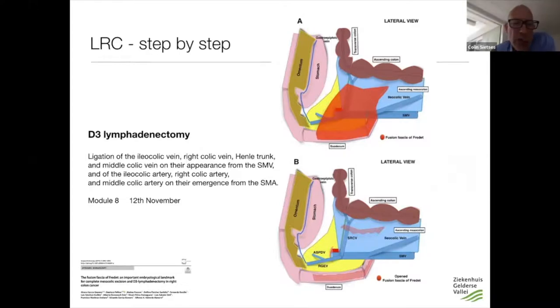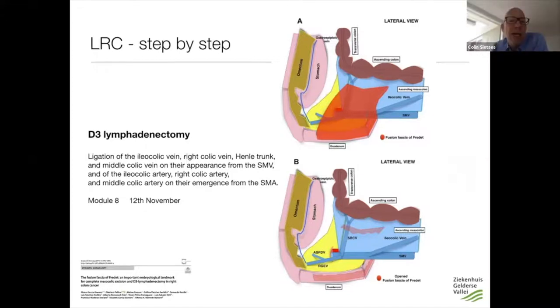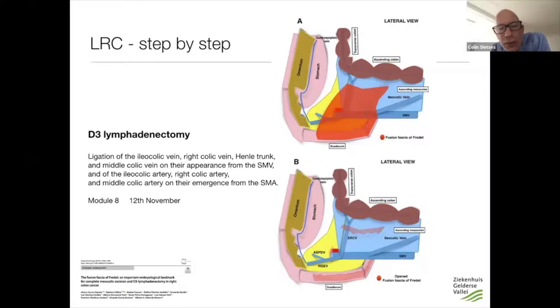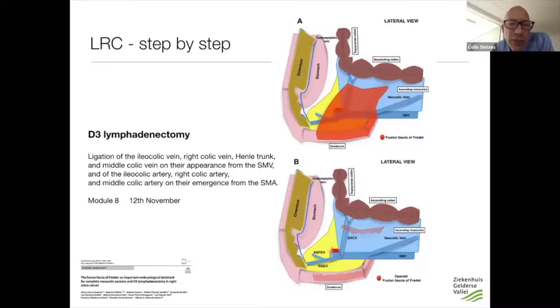D3 lymphadenectomy means ligation of the ileocolic vein, right colic vein, Henle's trunk, and middle colic vein all at their origin of the superior mesenteric vein, which means you have to dissect the superior mesenteric vein and completely free it. You also have to dissect the ileocolic artery, right colic artery, and middle colic artery at the origin of the superior mesenteric artery. This makes it a complex procedure. You have to realize before you start that this can have serious consequences and you can have serious complications.